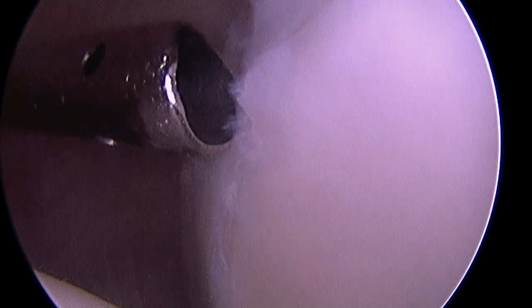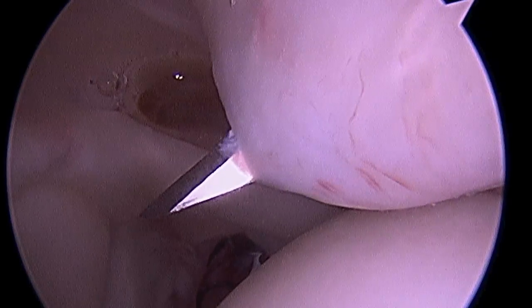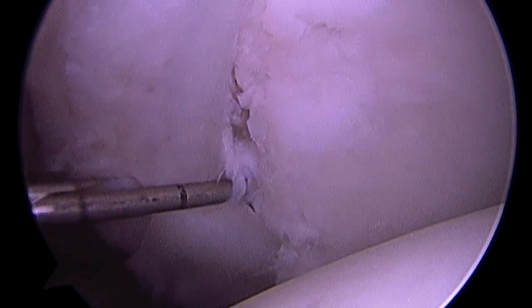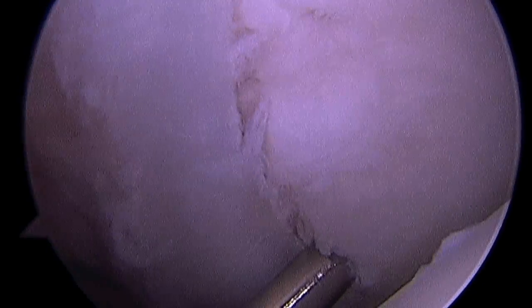So this is going to be something I'm going to look at from another angle. Here you see we're looking from anterior now, and that's the canal that my camera was in before. I'm probing the loose ligaments posteriorly as well as the labral tearing, or the reverse Bankart tear. So here we're establishing that third portal that we talked about, so now we can look down at the tear from above. To the right there is the cup of the shoulder, and below me is the ball of the shoulder. And to the left is the labrum and ligament of the posterior capsule, which you can see me probing and mobilizing away from bone, so that I'll be able to tighten it up appropriately and restore stability to the shoulder.